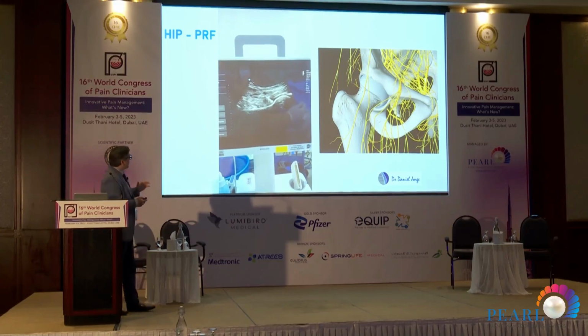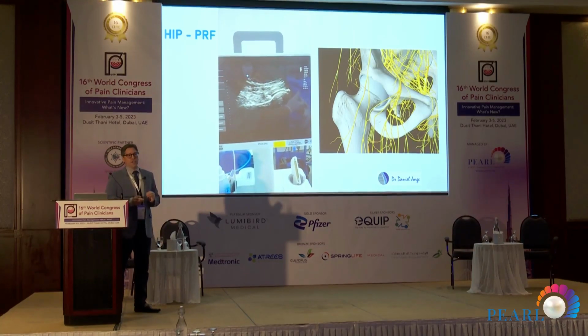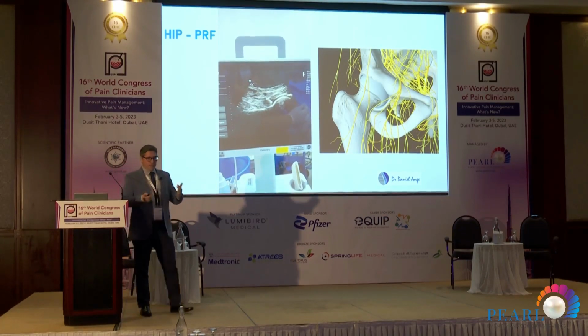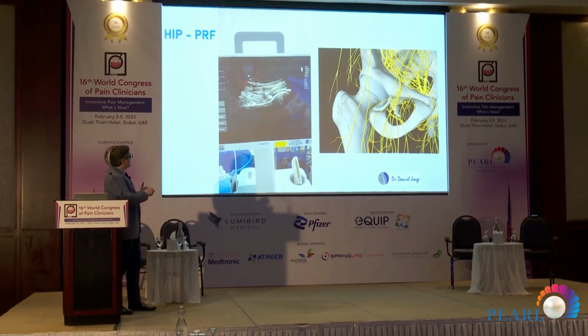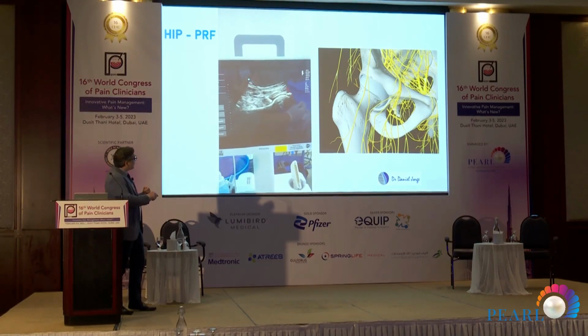And you can go just as you go for injection. This is an approach just for hyaluronic acid injection for the hip. You can go like that as another trick, and try to make things easier and safer for those who are starting to do it. So you can pull your needle a little bit up, down your hand, and you can reach this area with your needle.